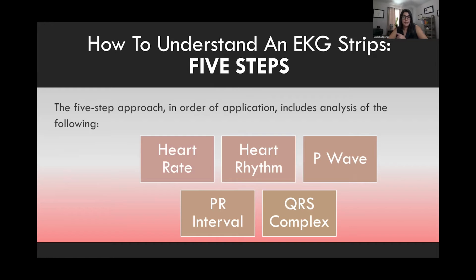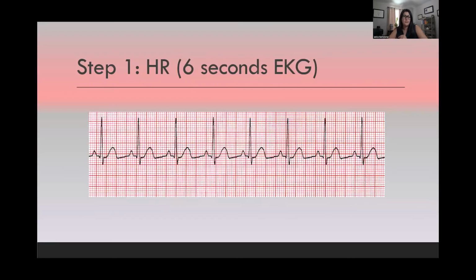So let's get started with the heart rate. Every time you want to determine the heart rate of an individual, a client, you are basically counting every QRS that you see.